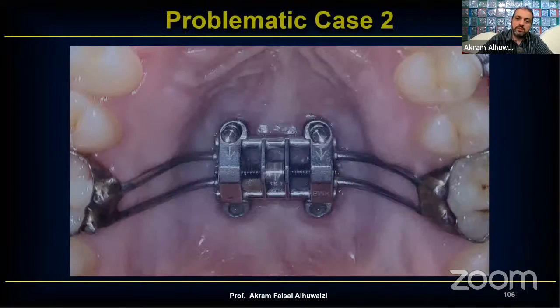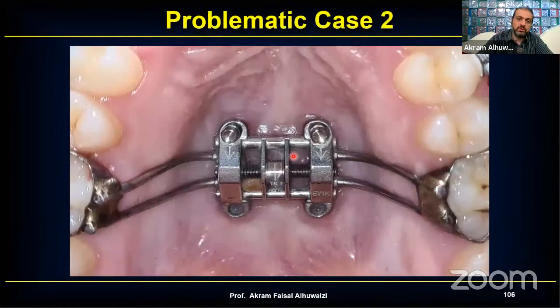Another patient comes in and he's lost 2 screws. And that was also fine because we've already opened up the suture. There's no problem with losing a screw or 2.